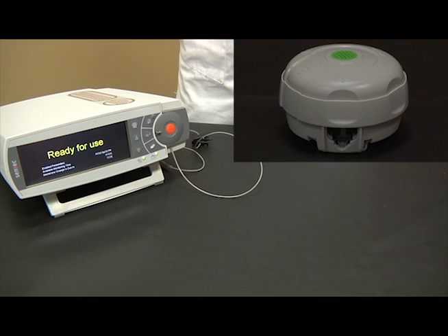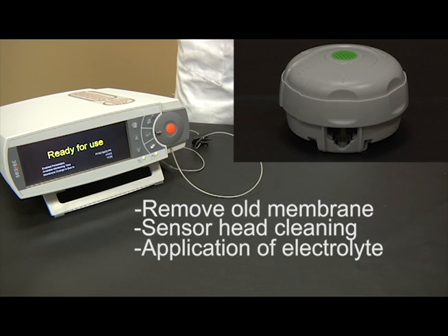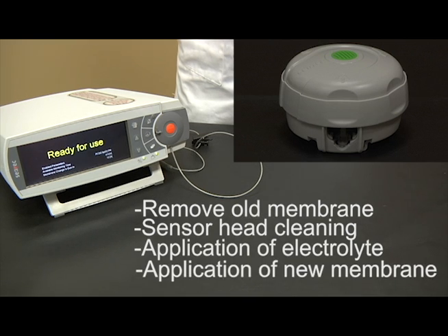When used as directed, the membrane changer will perform the following tasks: removal of old membrane, sensor head cleaning, application of electrolyte, and application of a new membrane.